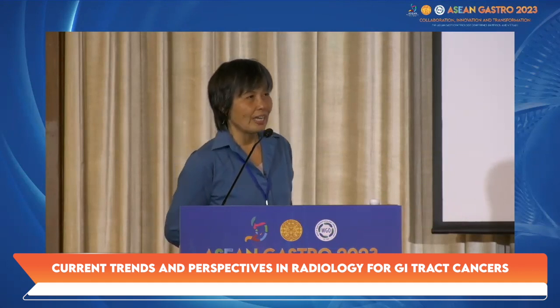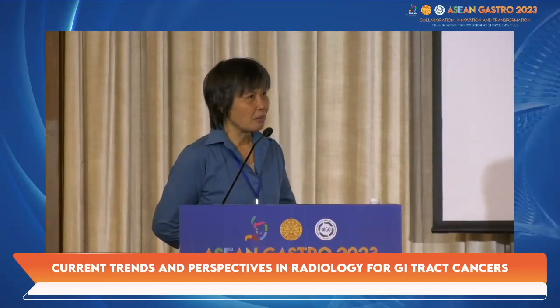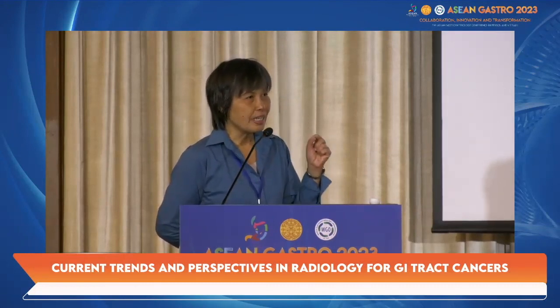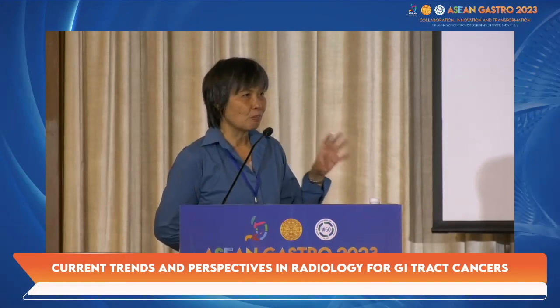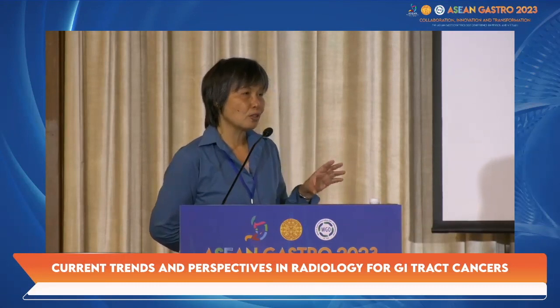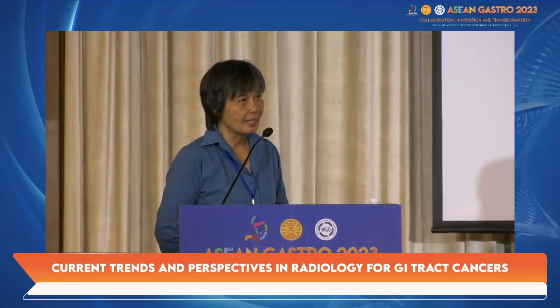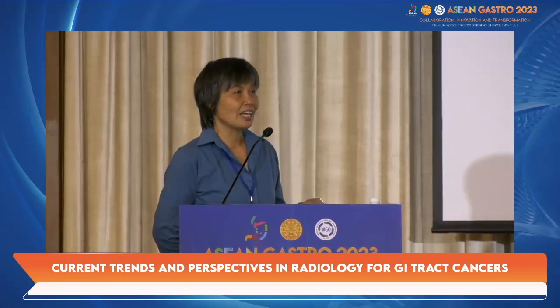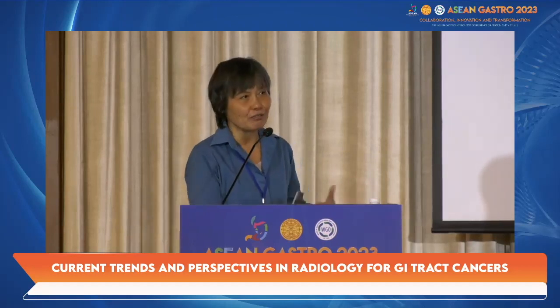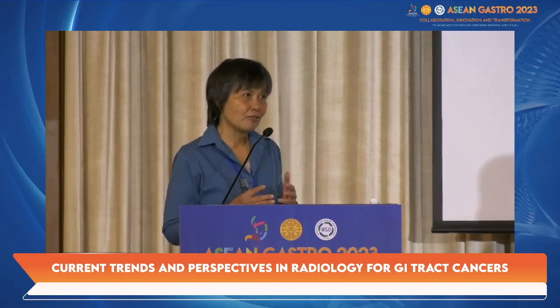But we have a way to deal with it, because sometimes contrast media is very important to completely assess post-treatment cancer. So if you cannot use contrast on CT, we would shift to something else, maybe a PET scan could have a role here, or MRI. There are a lot of alternatives. But I just tell you that in general, CT is the bread and butter for assessment of cancer.